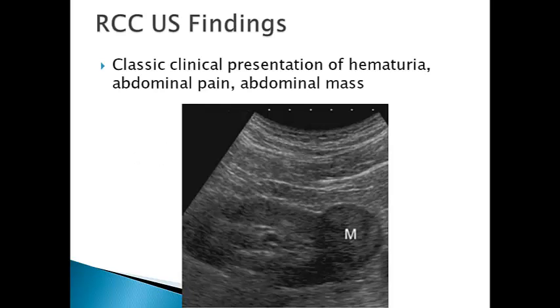Perhaps the most important renal mass that you can see on ultrasound is renal cell carcinoma, or RCC. Now, just a brief reminder, renal cell carcinomas present with the classic clinical triad of hematuria, abdominal pain, and a palpable abdominal mass. This is actually very uncommon for a patient to present with, however. Most renal cell carcinomas are actually found incidentally. The patients are asymptomatic. With the imaging we have today, these tend not to be found with the clinical triad. The patient may have hematuria or one of the different symptoms, but generally not the full-blown clinical triad. It's just not the case now.